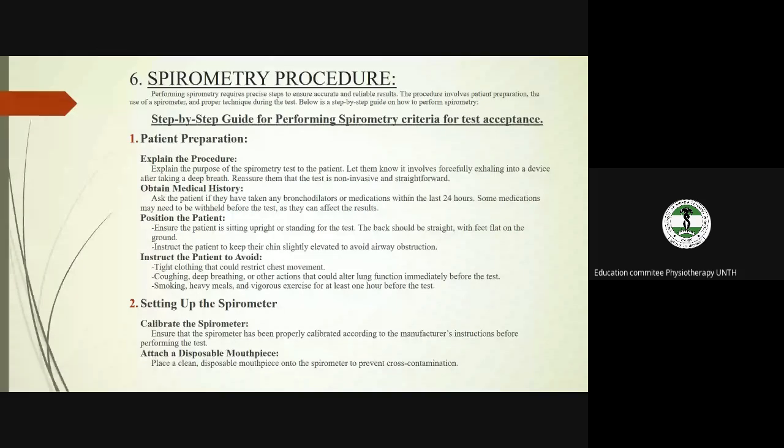Maybe after the test, if you want to do post-spirometry, you can give a bronchodilator to assess the type of asthma or the type of respiratory lung disease that the patient has. That one helps. Then you position the patient very well.